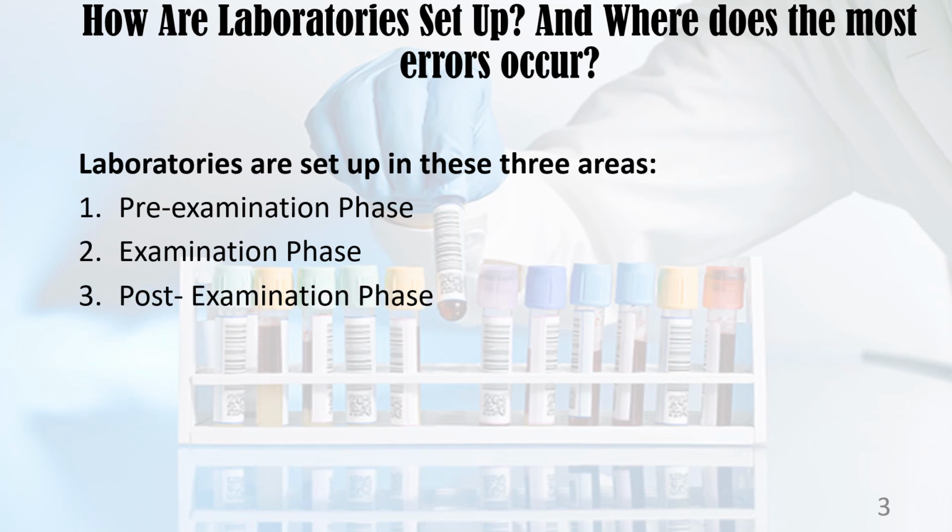Then this is followed by the post-analytical or post-examination phase. This is where the blood test results are going to be reported so that it could be sent to the doctors. Y después tenemos la parte de post-examinación o post-analítica, el cual es el área específicamente en donde van a reportar el hallazgo o los resultados de sangre.